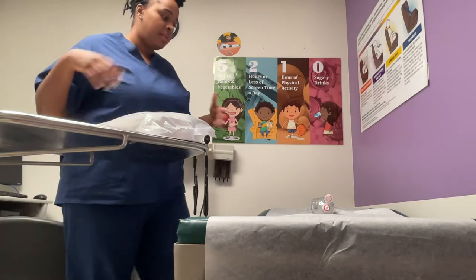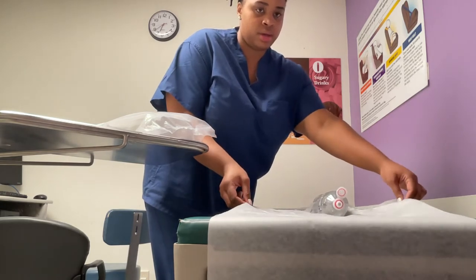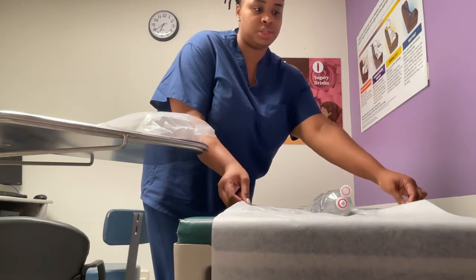I'm going to get you comfortable. I'm going to have you put your legs up. Adjust the patient.